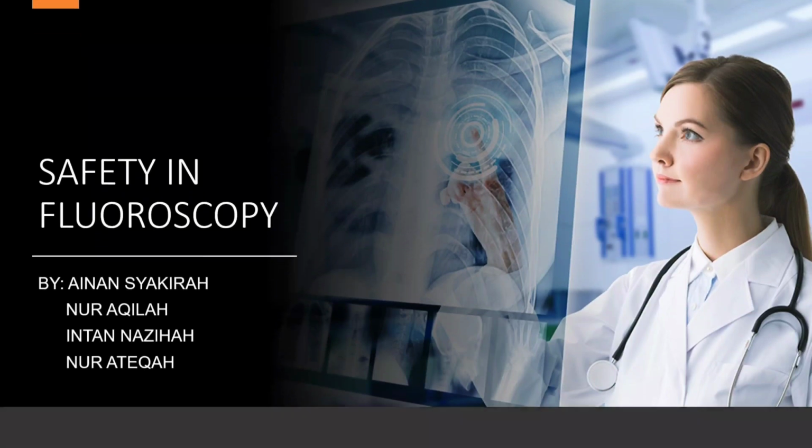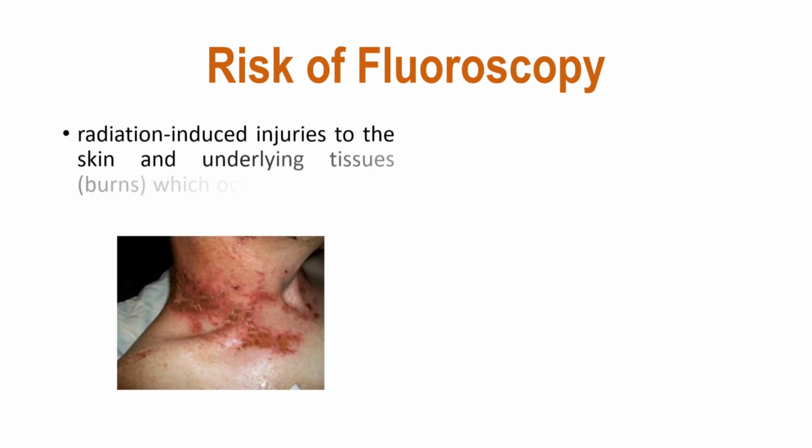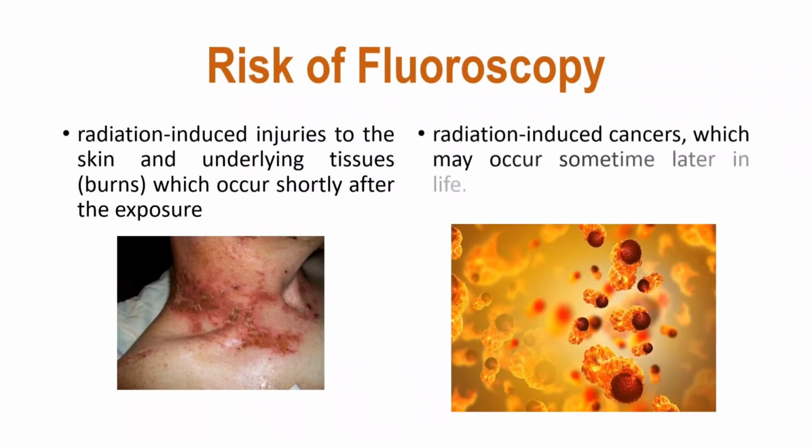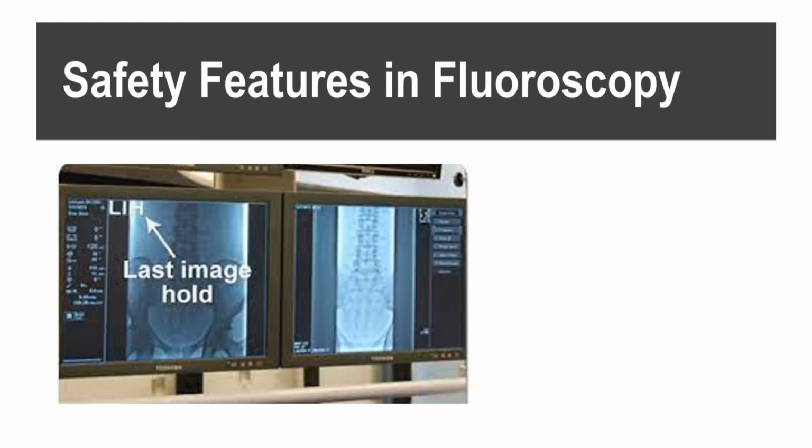So first things first, what are the risks of fluoroscopy? Well, shortly after the exposure, there will be risk of injuries to the skin as well as the underlying tissues that looks like burn. And since we're dealing with radiation, there is a risk for cancer which might occur sometime later in life. That is why safety features in fluoroscopy exist.